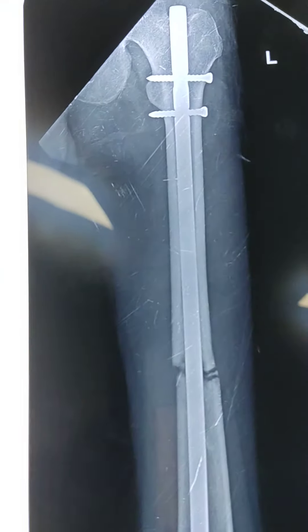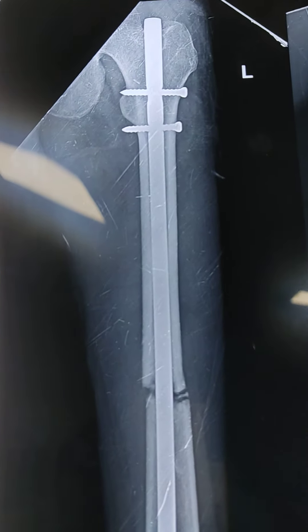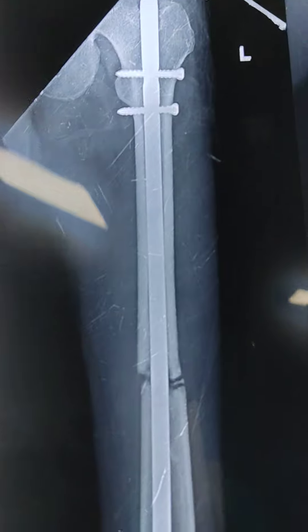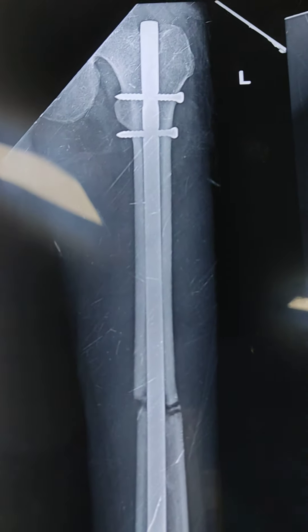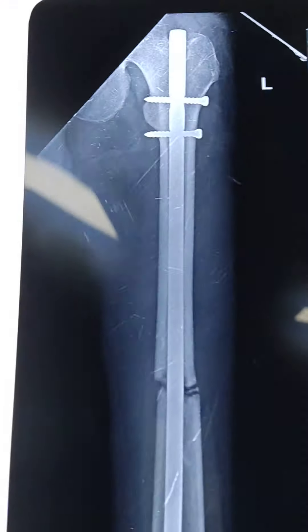Dynamization is usually done in long bone fractures like femur and tibia around 6 weeks to promote bone healing, to convert the static mode to dynamic mode where the movements happening at this hole will improve the fracture healing.